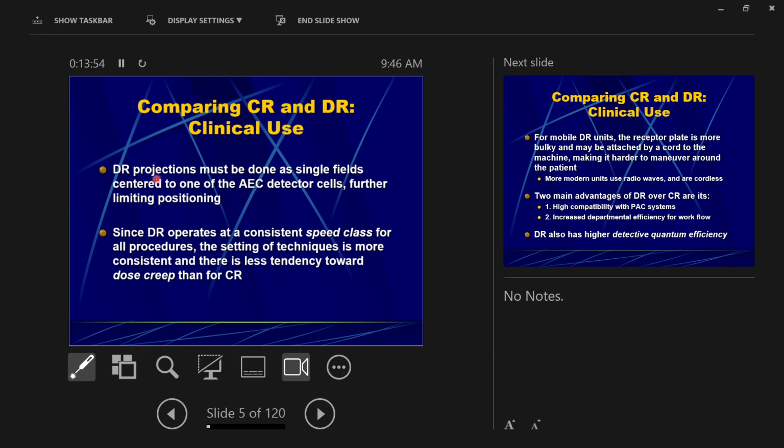That idea about saving money got turned into just a practice that X-ray techs did. Okay, X-ray techs, when they could, made multiple exposures on a single piece of film. Then when CR came out, we did the same thing. Okay, it wasn't to save money anymore. It was just because this is how we all had been taught. And so with CR, we would make multiple exposures on one image plate, and then we'd go take it to the processor after those exposures were done.